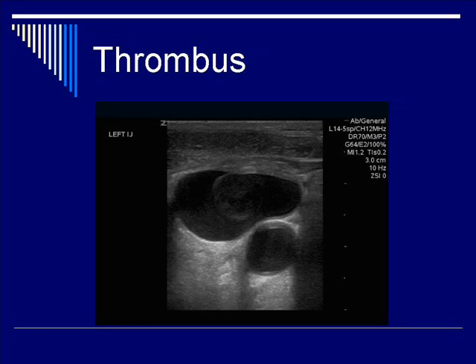So specifically, let's start with the anechoic structure: we have blood, which surrounds the hypoechoic structure in the middle. So the arrow is pointing to the black region of the vein. Next, we're going to point out the hypoechoic thrombus, which is the medium amplitude structure, residing within the internal jugular vein.